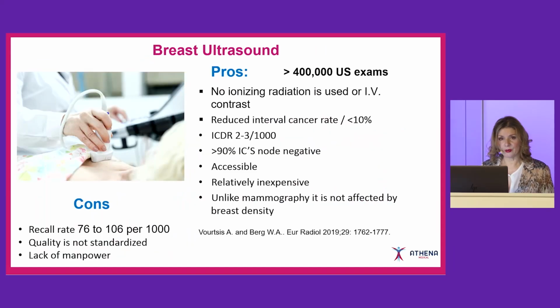So it happens that I have, as I believe most of you, a lot of experience with handheld breast ultrasound. I've been performing handheld breast ultrasound since 1997, when I was still at the university hospital located in Athens, called Areteo Hospital. At that time, no one knew anything about breast density and very little about breast ultrasound. We were still working with film mammography, of course. We had a woman that had dense breasts.